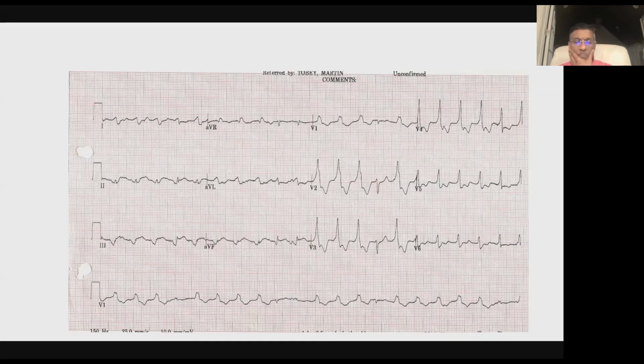Yes. So this is an ECG. I can't make out the P waves. There are broad complexes with ST-T depression and T inversions in V4, V5, V6. Okay. And then your decision is, what kind of rhythm is this? Is it some kind of supraventricular rhythm or a ventricular rhythm, and what to make of it? Any thoughts?